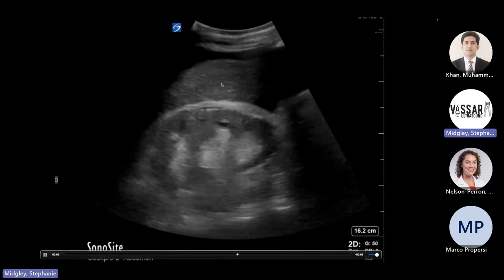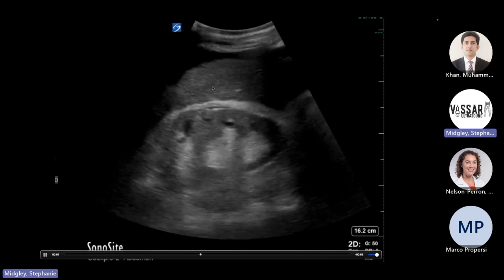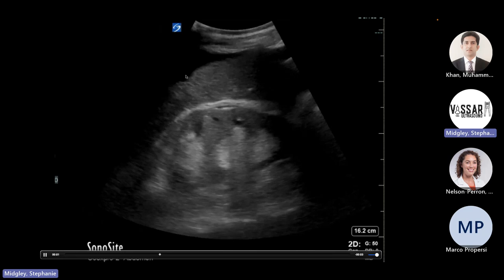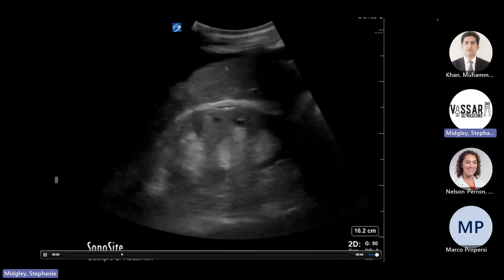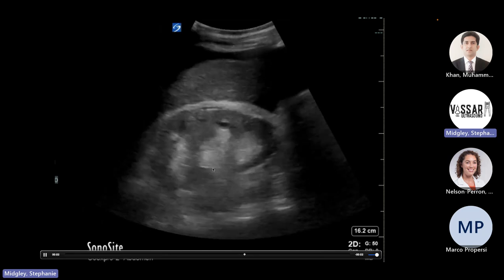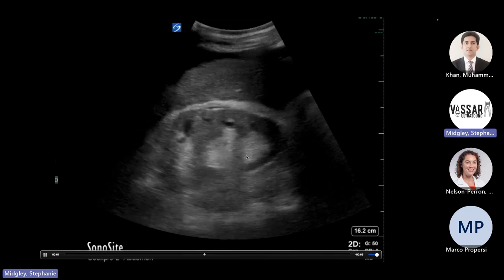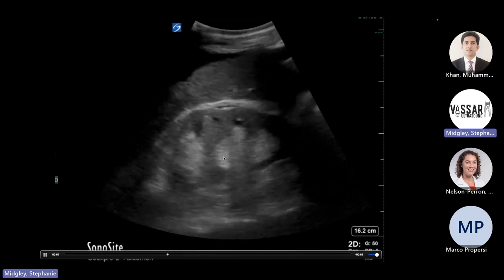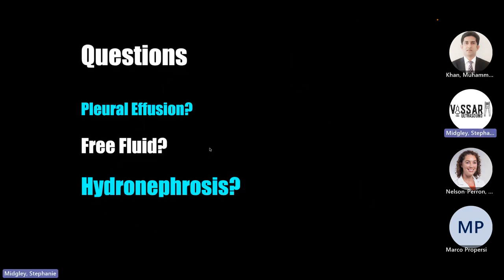And then this one is obviously positive. But the other thing, if we look at the liver, it's definitely quite a bit brighter than the other livers that we saw. And if you notice, it's lumpy, bumpy. So this is more cirrhosis. And then if you notice, the kidney looks kind of funky too, how it's bright white within that kidney. And so this is what we call nephrocalcinosis. So this person has a medullary sponge kidney. So it's common for that one.